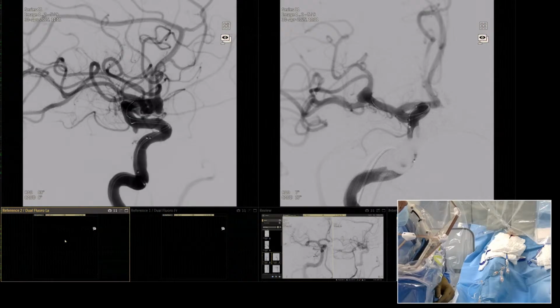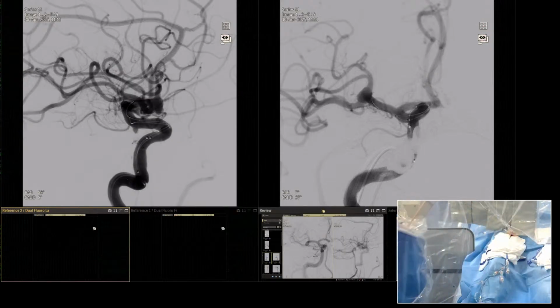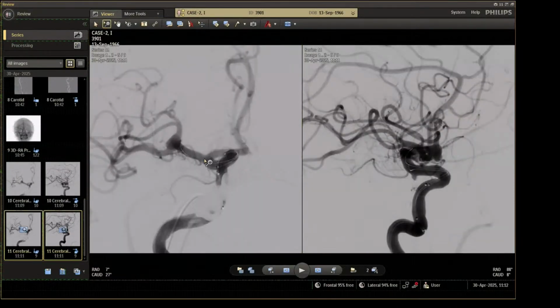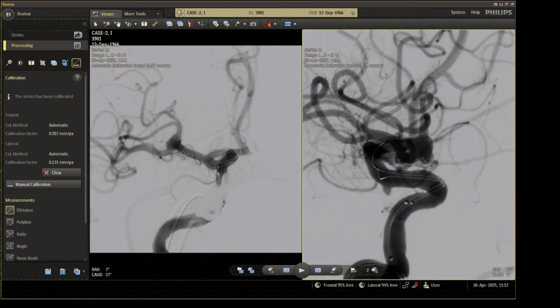Now I will ask Abzal to measure this part of the aneurysm. For me, it is on the lateral. As on review, it again like this on working. Hold. The neck is quite obvious. Okay. Delete mask.